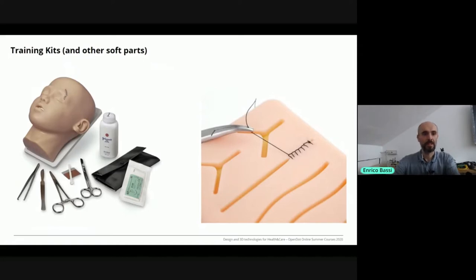Very often it's something soft because we simulate tissues in the body. But if you consider bones, for instance, or cartilage, those are not that soft. So the capability of widening the range of the shore grade, the stiffness of the material, is very important. Now, beside the basic examples, our objective is not to replicate what's available on the market, but to actually make things that could be useful for someone that is not yet on the market. That's why we speak a lot about innovation.